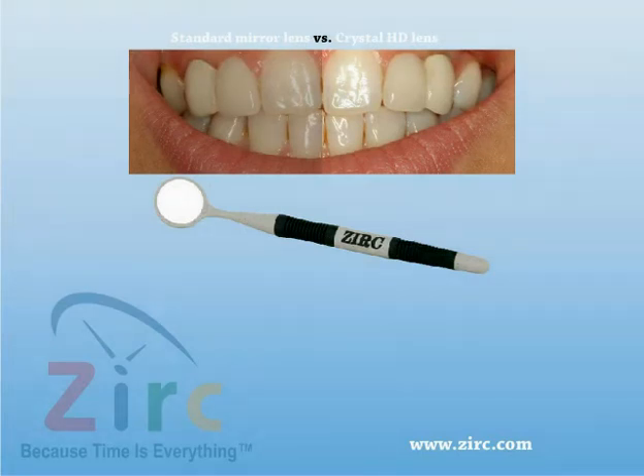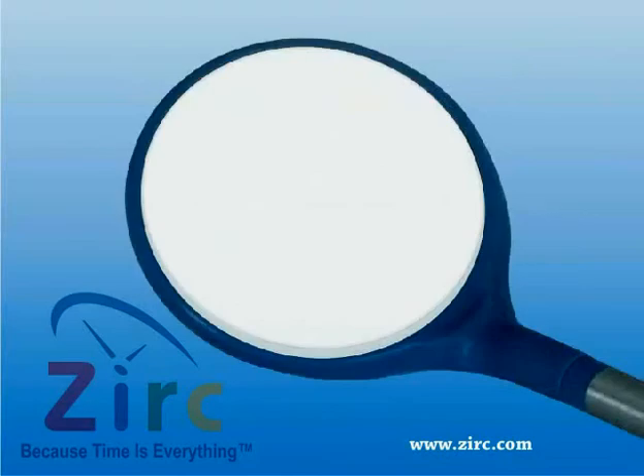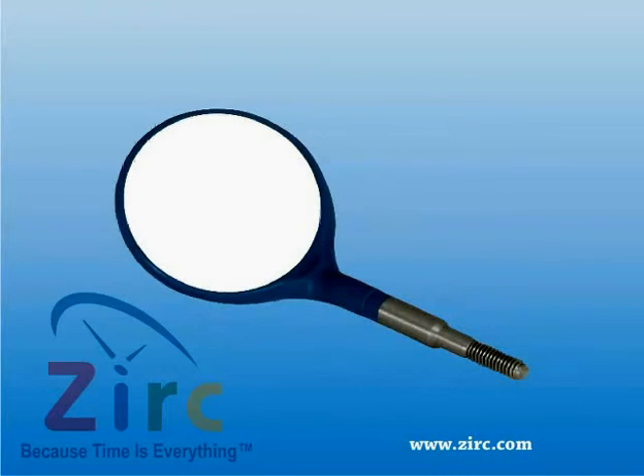This lens causes less fatigue on the practitioner and can reduce eye strain as well. Zerk's line of plastic mirrors contains several unique features. The lens is flush with the mirror frame so there is no gap, and this helps in eliminating the possibility of corrosion buildup on the mirror head.